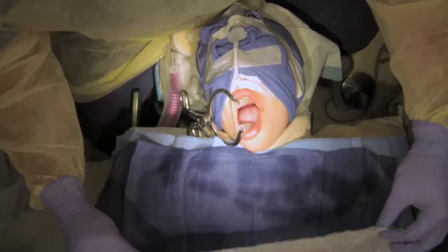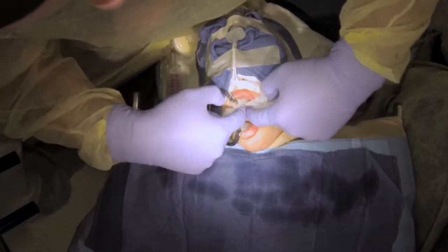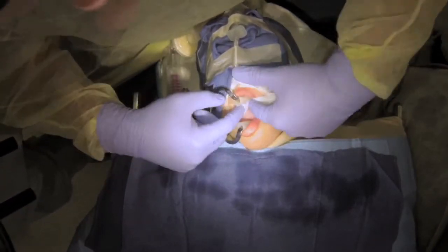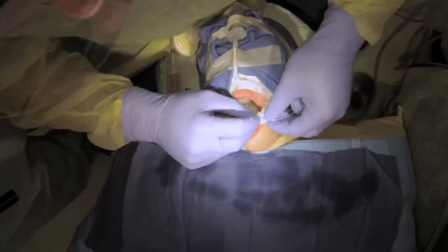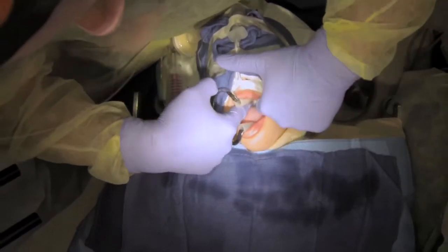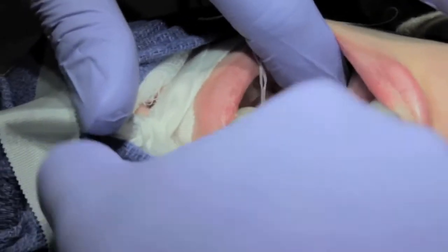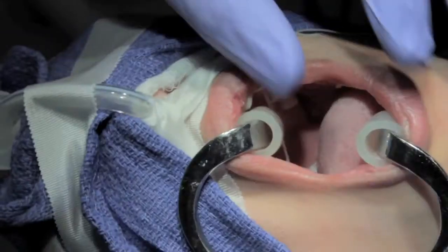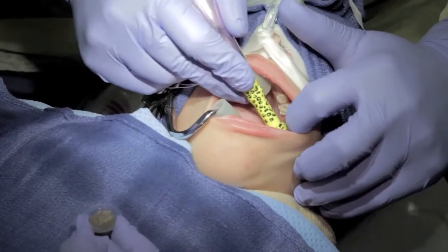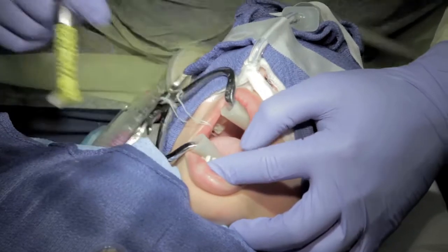Step one is always to put a throat pack in and protect the airway. Make sure nothing falls back into the lungs or stomach. Just snake it back and forth into the oropharynx so that it's completely full — that way anything that falls back there is very easy for us to pick up. Always do prophy first.